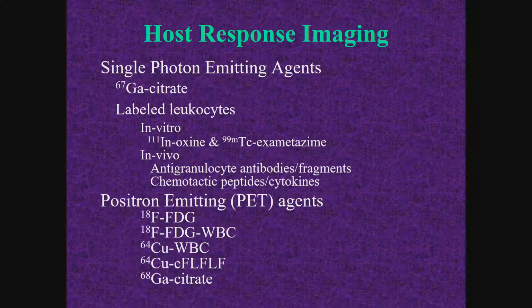The other thing that's important for us to remember, and I'm not going to go through this whole list, is that everything we're doing today in terms of infection imaging is host response imaging. We do not have a single agent that is specific for infection. A reviewer once criticized a paper that I had written saying that white cells is specific for infection. No, white cell imaging is not specific for infection imaging.